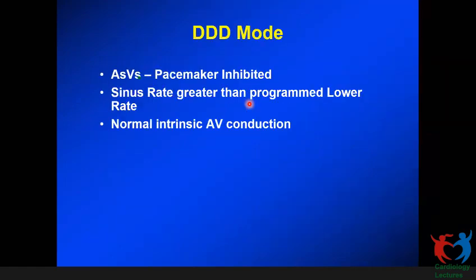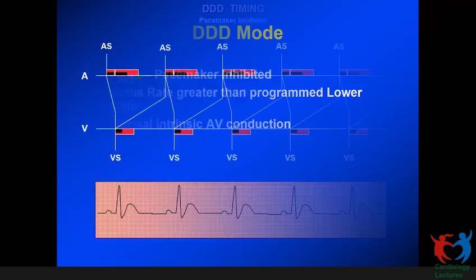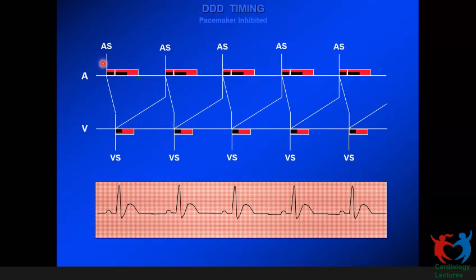And the other one is, yes, if you have given a pacemaker for an intermittent bradycardia patient, where there is a need for pacing only occasionally, then ideally you program the lower rate low enough and the AV interval long enough to allow intrinsic activation to take place. Here, because the lower rate is very low, we are sensing the atrium, since the atrial event is faster than the lower rate that we program.